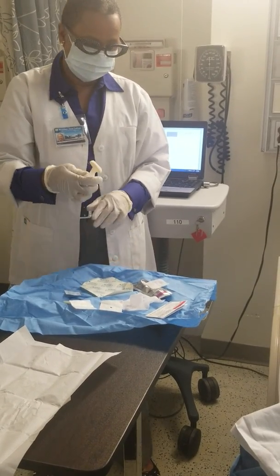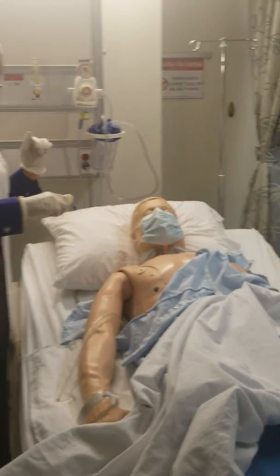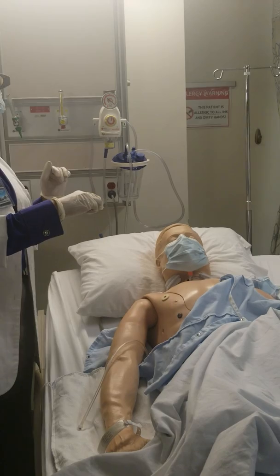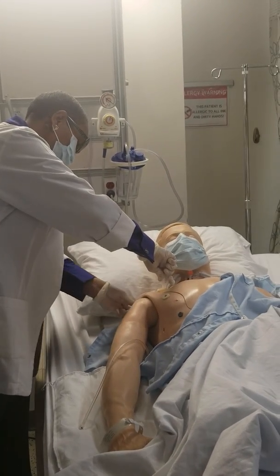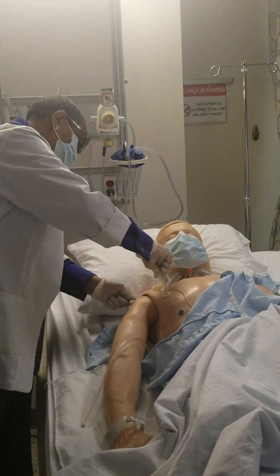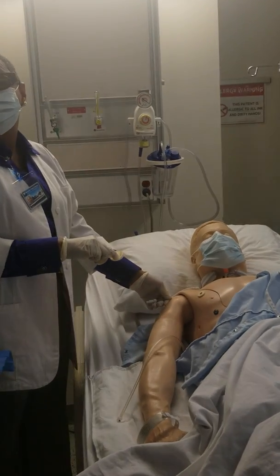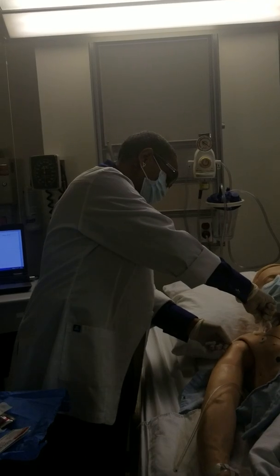Okay. So when you squeeze this down, move to your patient. Which way do you want to clean them? Inside out, circular? No. This is the way. This is chlorhexidine. You want to scrub this back and forth, right over the site. Oh, she did that, but that's because she was doing a PICC, and she was using the swabs, and it was iodine. This is chlorhexidine. Two different surfaces.